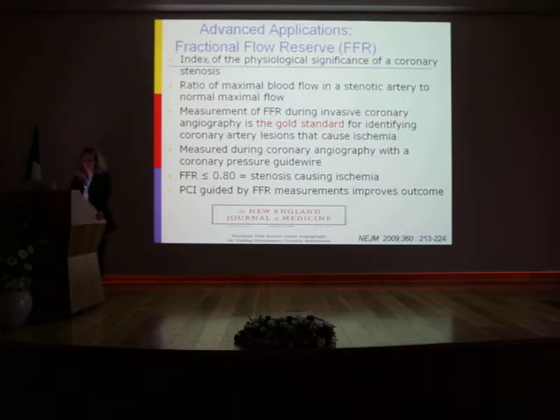And another advanced application, which I think is something like science fiction, is this one, fractional flow reserve. As you know, fractional flow reserve is the index of the physiological significance of coronary stenosis. It's the ratio of maximal blood flow in a stenotic artery relative to the normal maximal flow. And the measurements are done during invasive coronary angiography using a pressure guide wire. Measurement of FFR during invasive coronary angiography is considered the gold standard for identifying coronary artery lesions that cause ischemia.